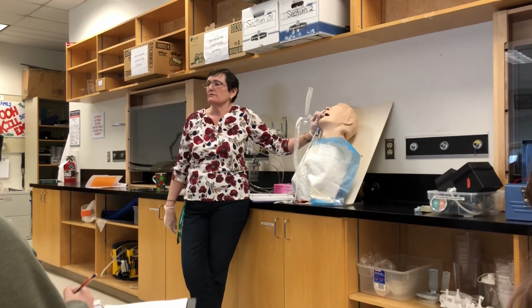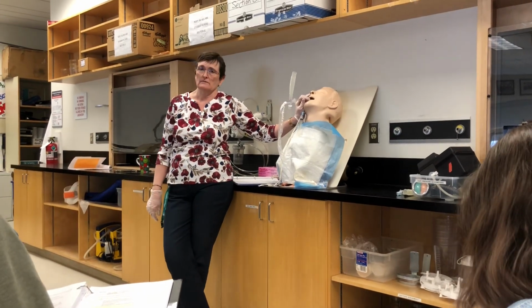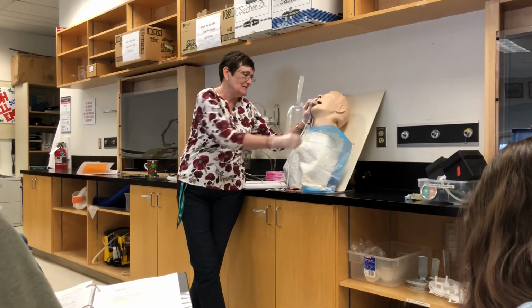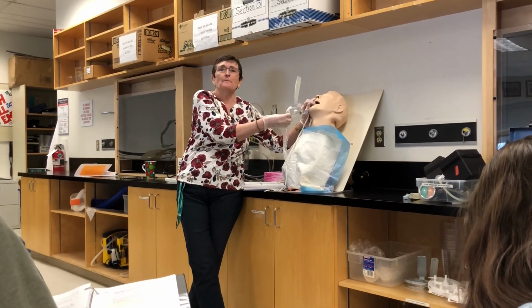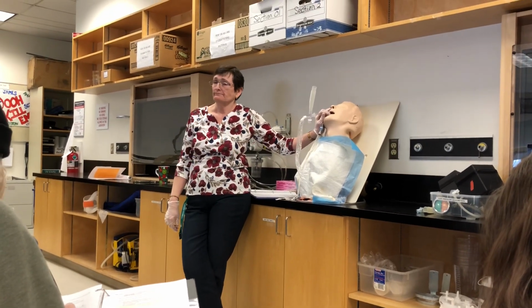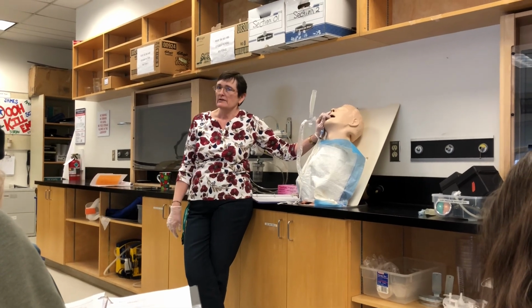So with extubation, we have him take 3 big breaths, okay? And on the 3rd breath, on peak inspiration, I'm going to deflate the cuff and pull the tube. So you kind of have to time it with his inspirations.